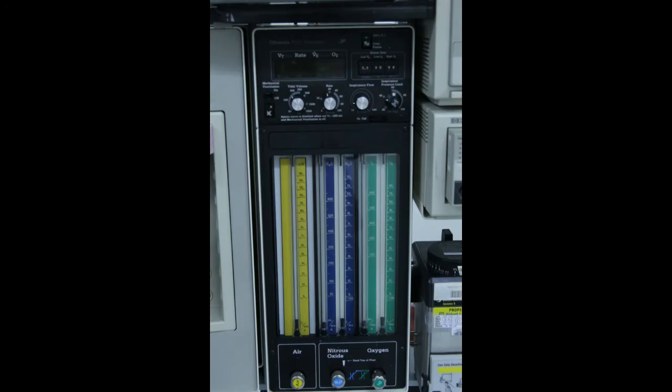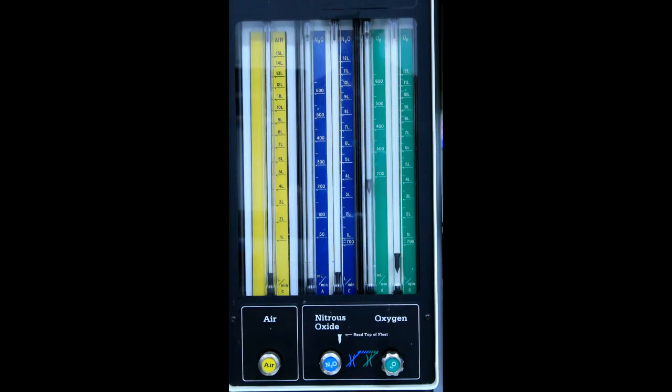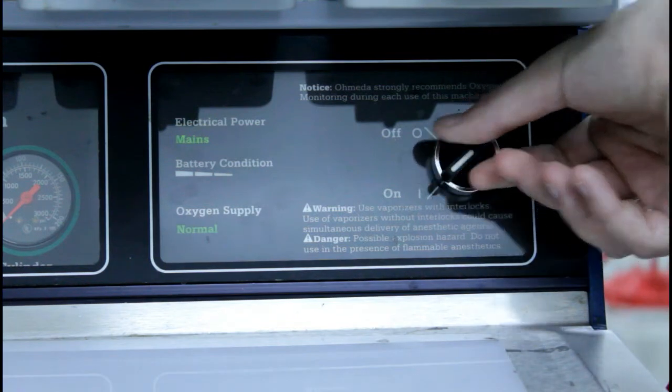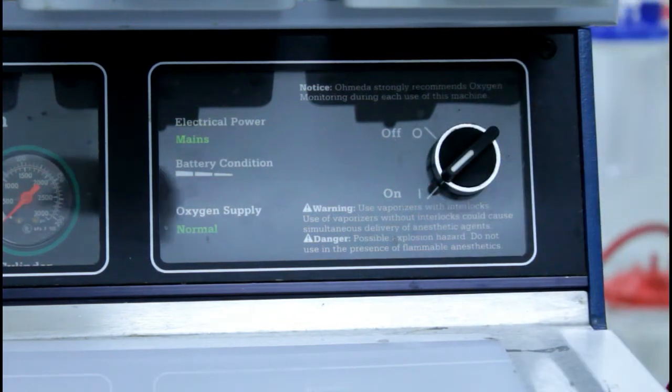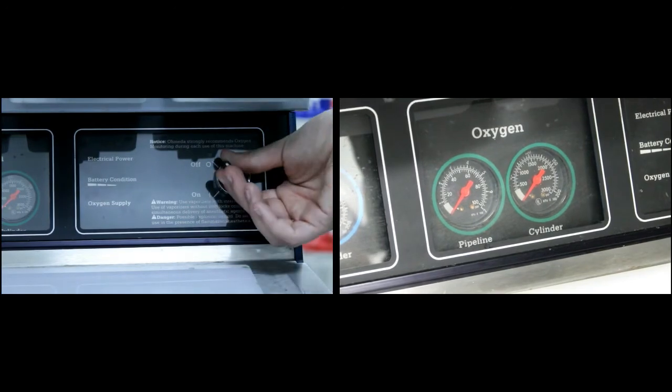The function of the flow meters is to measure the amount of each gas that is being introduced to the anesthesia circuit, and should not be mistaken for measuring the amount of vaporized anesthetic. When the system is plugged in to the central source, the pressure readings on the flow meters all go up. When the machine is turned on, the oxygen reading goes up to about 250 mL per minute and will not drop below this level so that a hypoxic mixture is not introduced.